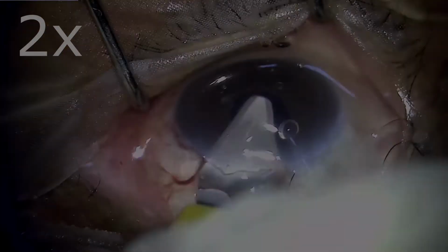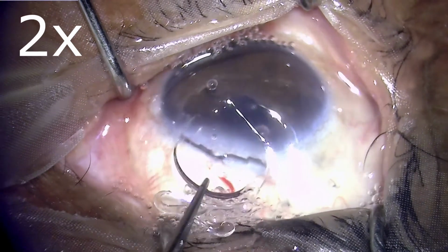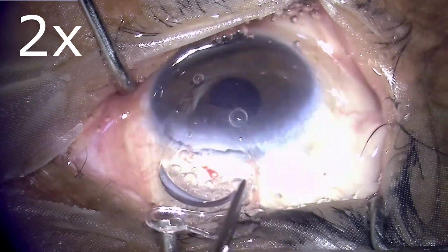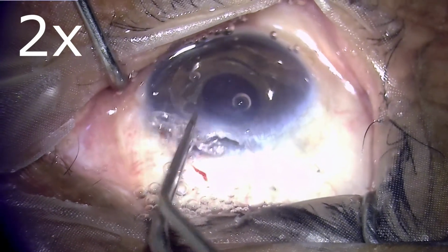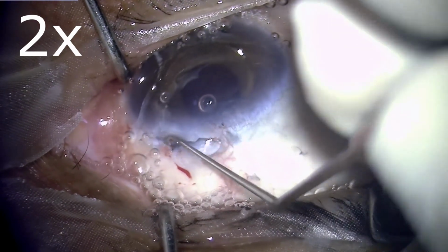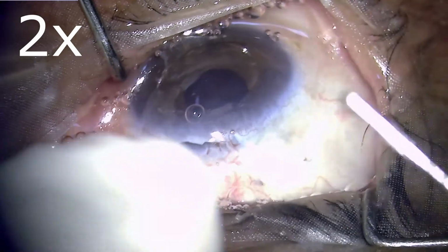I have made a clear corneal incision for a reason, because this patient also had a corneal astigmatism of 3.5 diopters. It might have been because of a pre-existing issue or may have been surgically induced, but in that scenario I wanted this large clear corneal incision to help neutralize the corneal astigmatism.